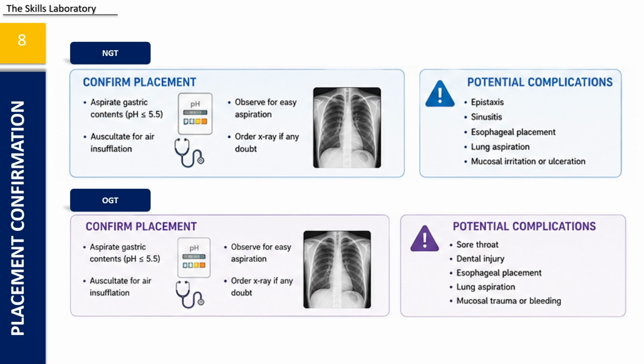You place the diaphragm of your stethoscope at the gastric area or the stomach area, and then you push your aseptic syringe and insufflate with air, and you try to hear for the gargling sounds in your stomach. If there's gargling sounds upon insufflation of the air, then you can say that the tube is already correctly placed. Okay, and then after that you secure your tube in the area.